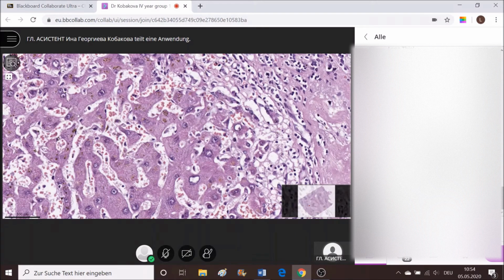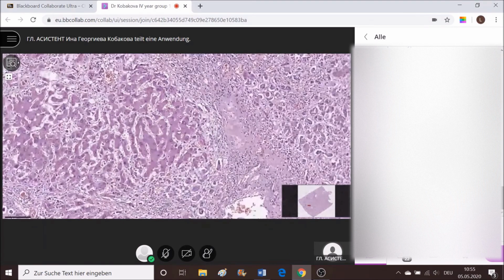And if I take a closer look, I might even be able to see the hepatocytes, which are regenerative. And in some of these I might be able to see nucleoli on the inside. This, according to me, is a hepatocyte with 2 nuclei, which is a regenerative one. And it could be randomly observed inside regenerative nodules. But I don't see a triad here, at least not here, but I would be able to if I take a look at other places on the slide.